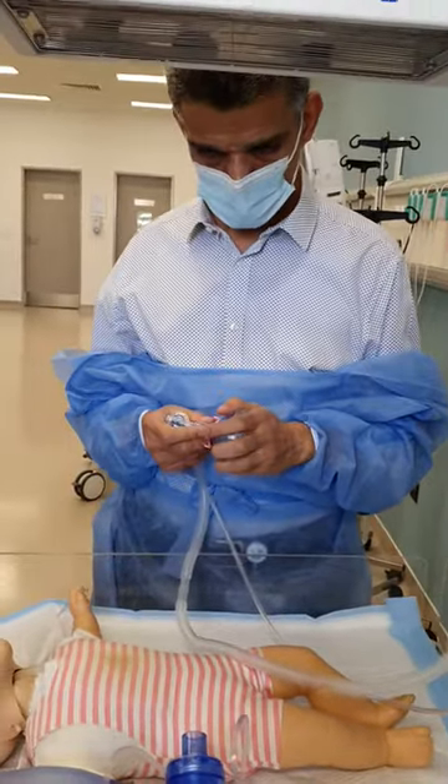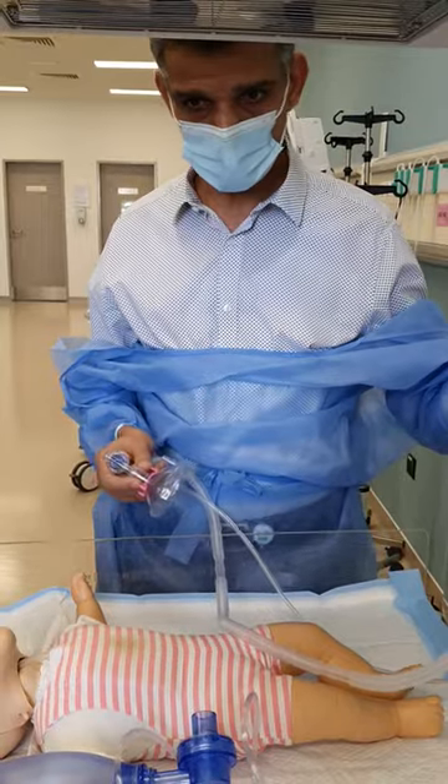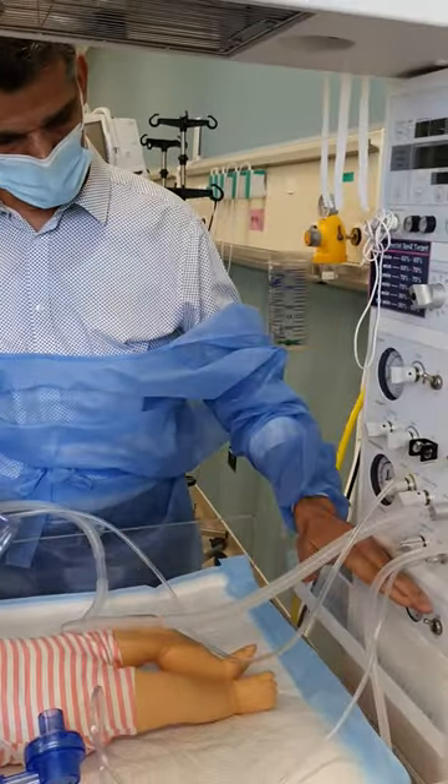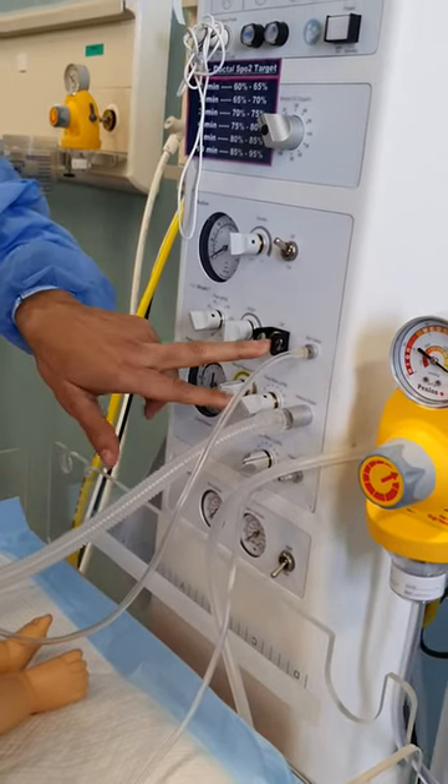We will do positive pressure ventilation or PPV using the resuscitator. First you need a pressure source — turn it on — and then you need to turn on the ventilator.